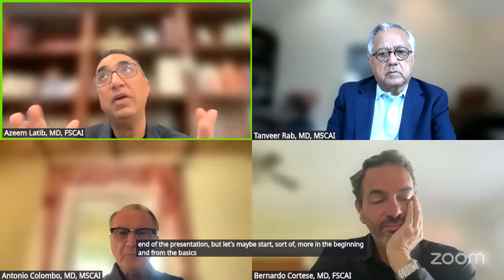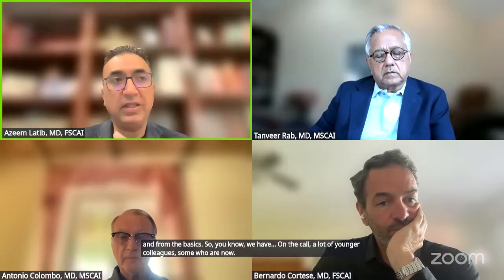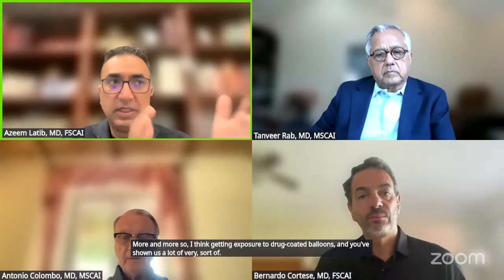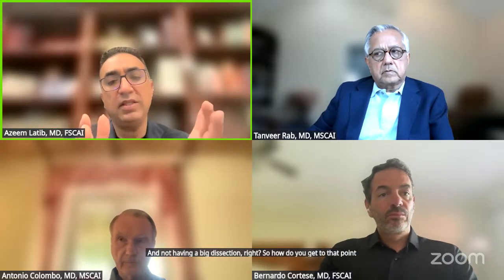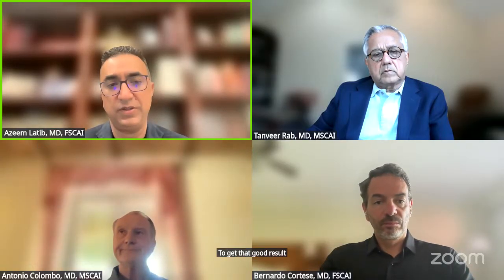So, we have on the call a lot of younger colleagues, some who are now more and more so, I think, getting exposure to drug-coated balloons. And you've shown us a lot of very interesting cases, bifurcations, long lesions. Maybe just taking it back to the basics. Part of getting a good result with a drug-coated balloon, you mentioned, is having good lesion preparation and minimal residual stenosis and not having a big dissection, right? So how do you get to that point? What are the tips, the Colombo tips and tricks to get that good result without a big dissection?